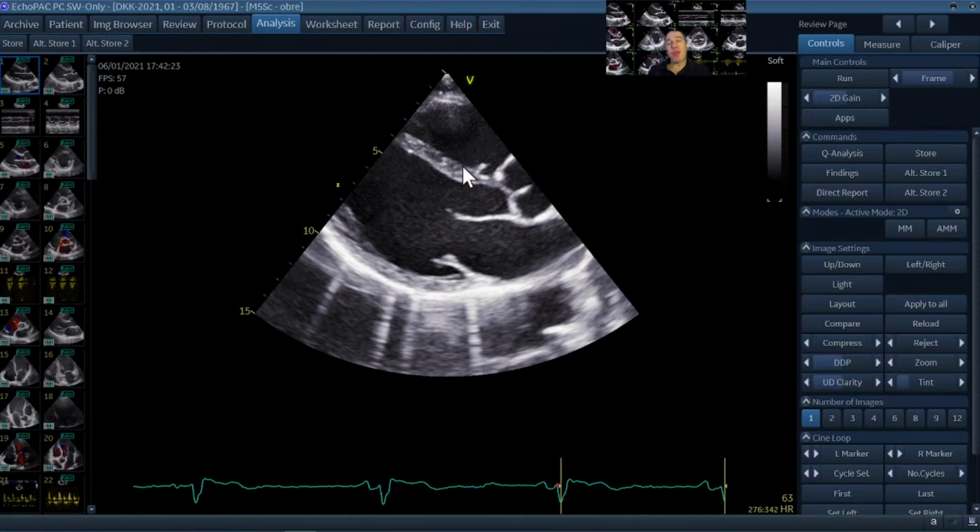And here we want to measure the left ventricular diameter from the anteroseptum to the inferolateral wall. We also would like to measure the thickness of these walls, and this is measured in a perpendicular direction, on a line perpendicular to the long axis of the left ventricle. So the long axis is from the left atrium through the valve to the virtual apex, which is not clearly seen here. That's a long axis, and in a perpendicular direction we measure the dimension of the left ventricle.